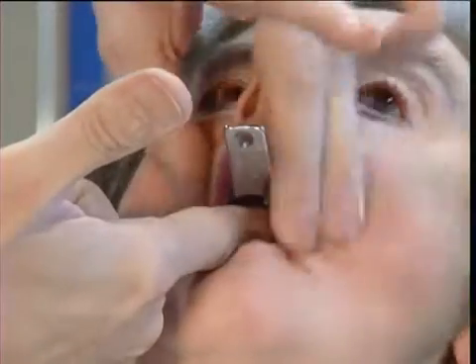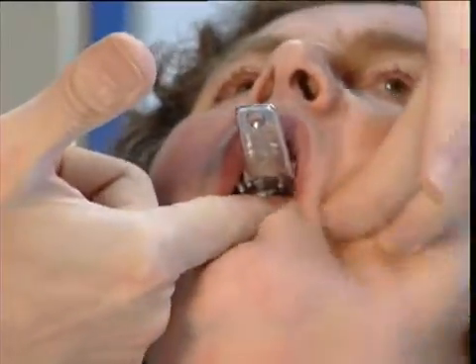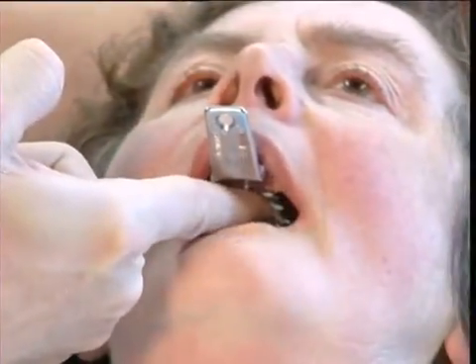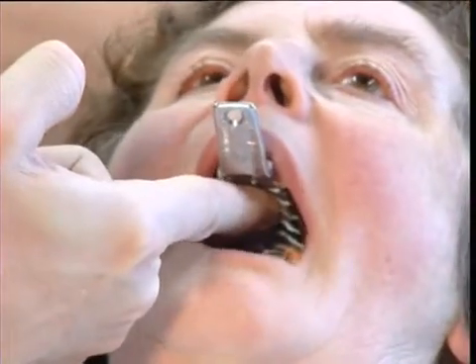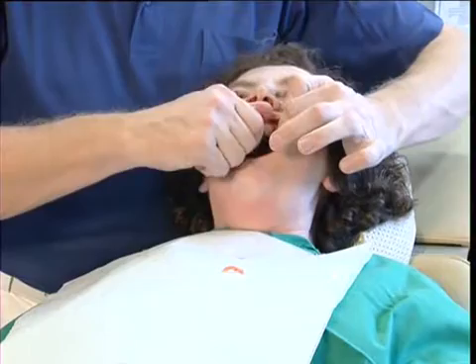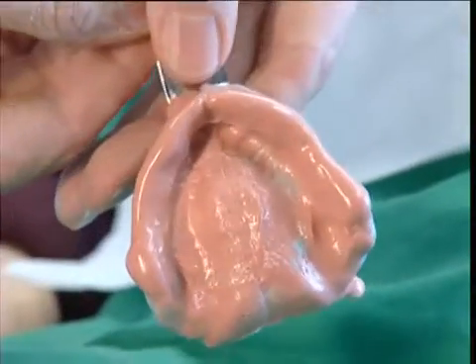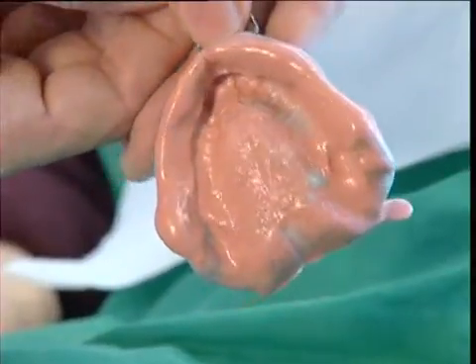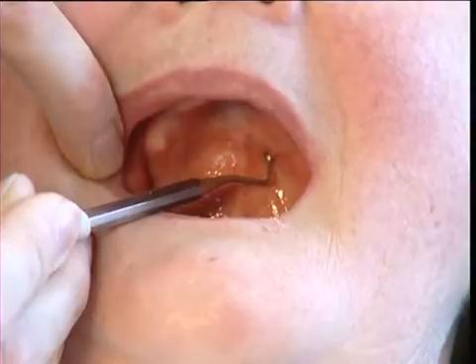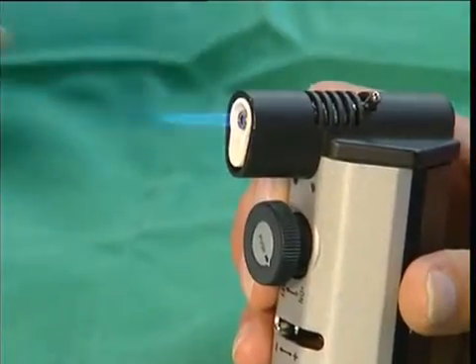During this phase, it is especially important to massage the cheeks vigorously and to ensure that the patient completes excursions of the jaw, as the soft paste takes a particularly detailed impression of the muscular tissue. A ball-end probe is used to palpate the palatal vibrating line, and an impression taken of it using composition.